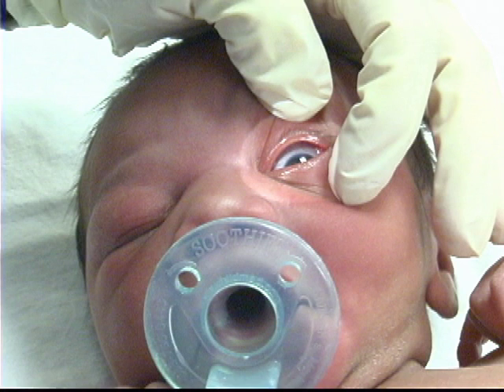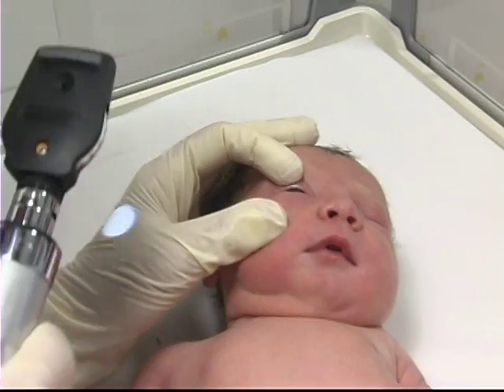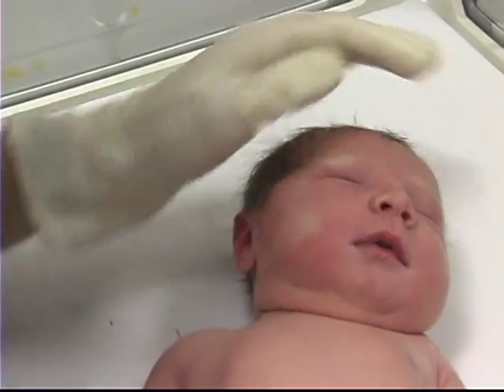Assess the size, shape, and placement of the pupil and iris bilaterally. To assess for the retinal reflex, set the ophthalmoscope at 0 and approach the infant's eyes from the side of the head to a distance of 6 inches from the eyes. Progressively dial up to higher numbers on the ophthalmoscope until focused.